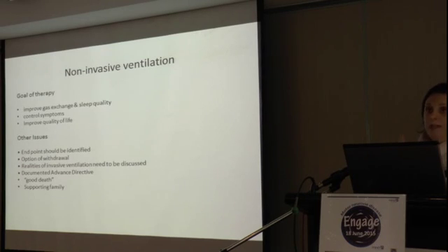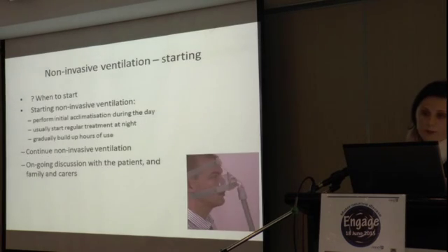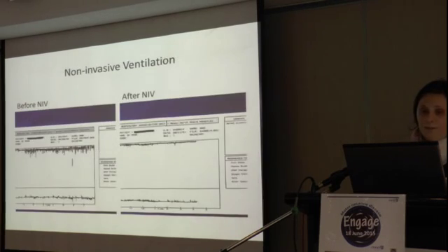It's not just saying, you need this, take it home and deal with it. So you need to consider lots of things in their everyday life and function. So what we tend to do with our clinic is when we start non-invasive ventilation, we bring patients into the hospital for 2 to 3 days. And then we manage that so that they have enough education and support in regards to that. And you slowly start introducing it maybe 2 hours a day, and then slowly build up to what level they feel like they need to do it. And you're continuously monitoring and observing patients.